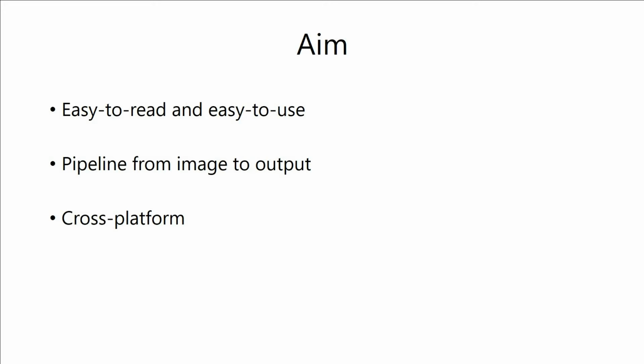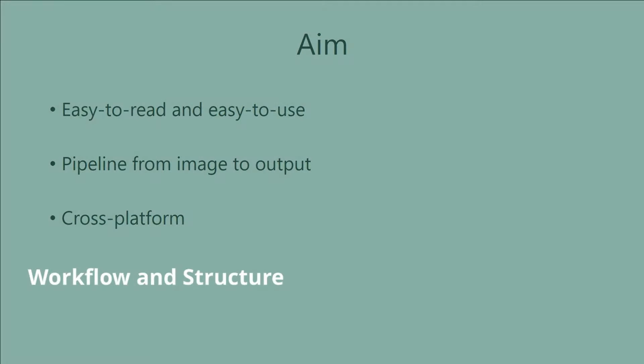It is implemented in Python, which has established itself as a popular language in scientific computing and can be installed on Linux, Windows, and Mac OS X.